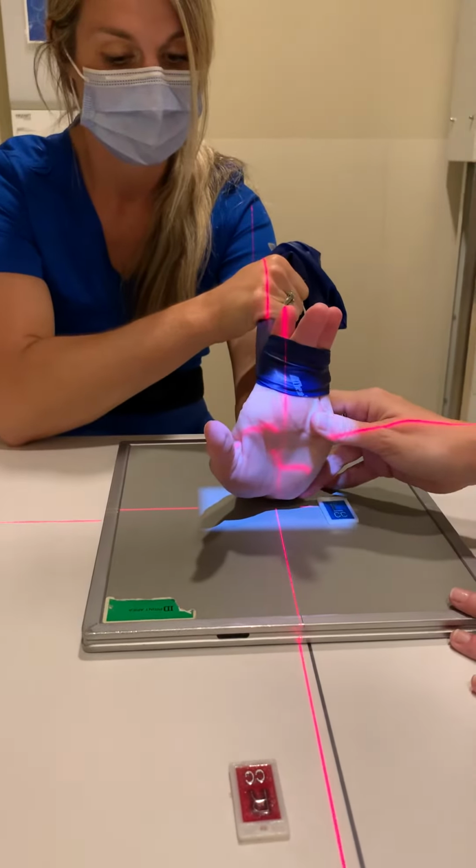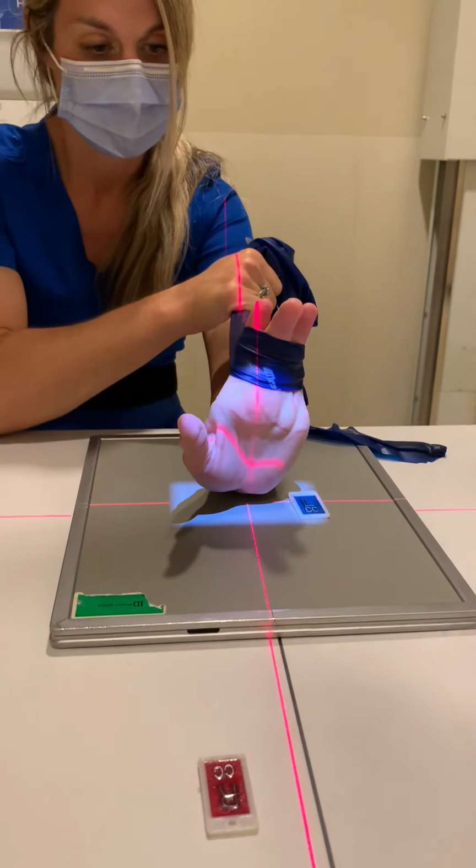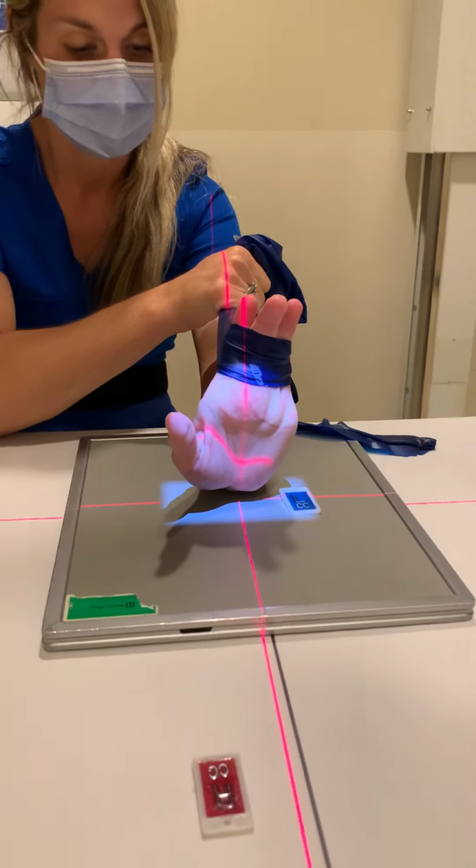If your patient is unable to keep their hands flexed, you can use something to help them hold their fingers back.